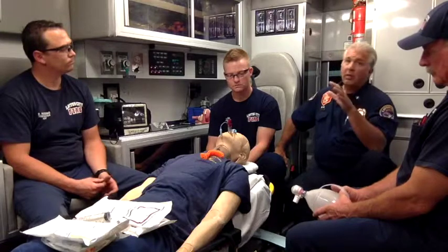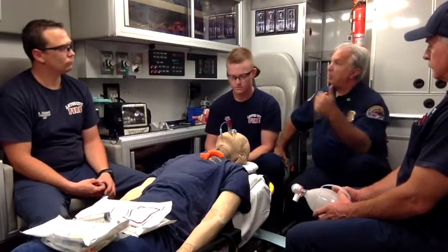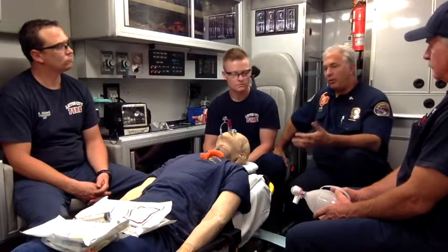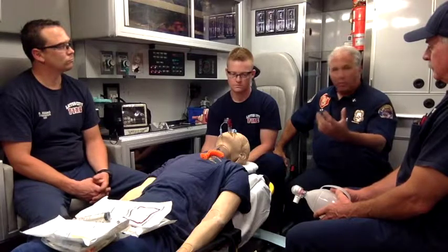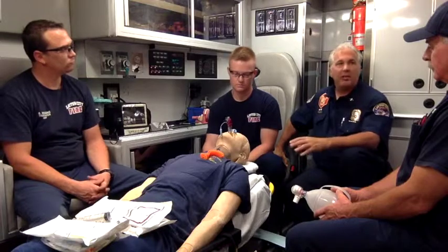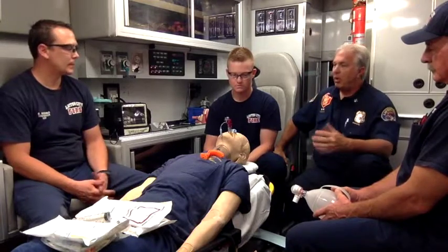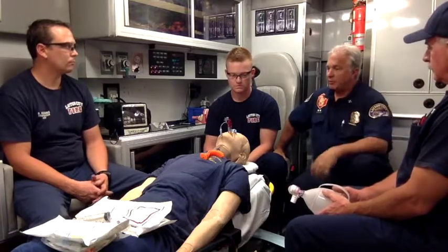So now there is still that discussion about what we are doing to the brain during cardiac arrest. Now, they'll be the first to tell you in that study, it depended on CPR. Most importantly, it depended on how good you were at intubation. Did you have to stop CPR? And so I will tell you that with us having video, and with us having guys that I believe overall are very good at intubation, we should be able to intubate somebody under the video while still doing chest compressions, and that will probably help them get ROSC better and help them survive to be a taxpayer instead of sucking on a vent down at South Davis Metro.